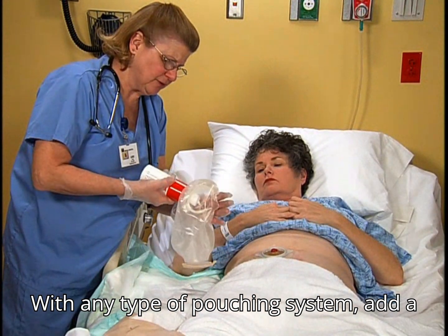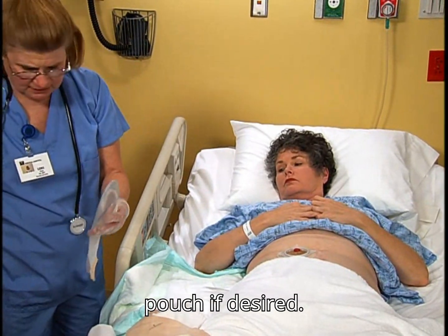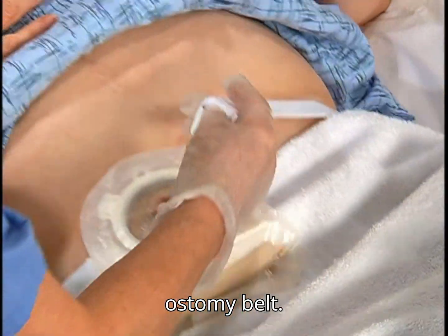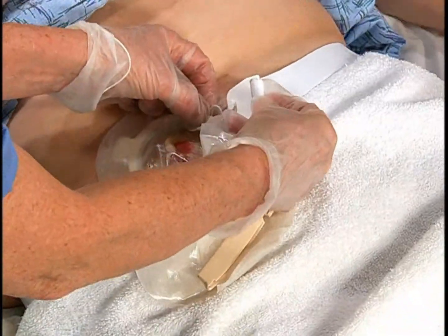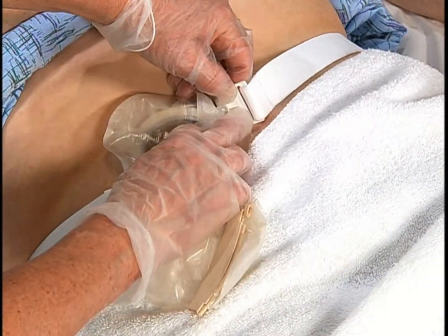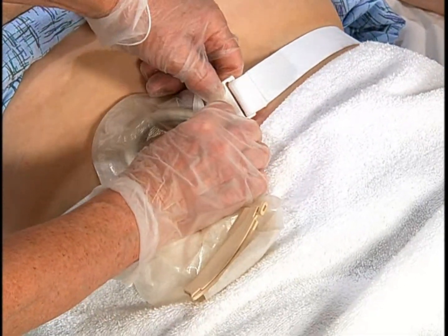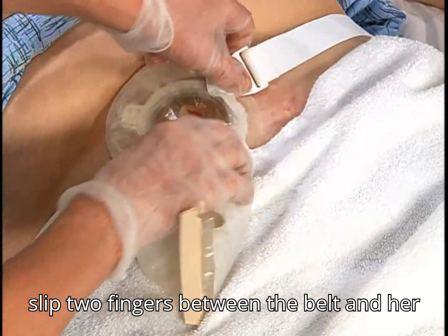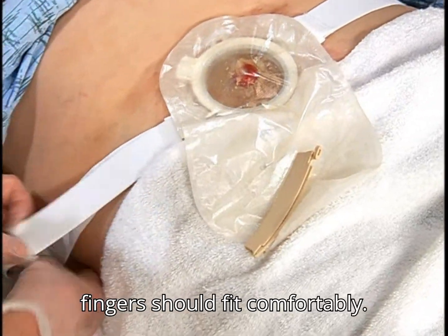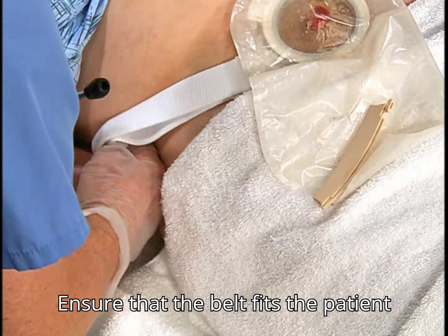With any type of pouching system, add a small amount of ostomy deodorant to the pouch if desired. If the patient desires, apply an ostomy belt. To ensure that it's not too tight, slip two fingers between the belt and her skin. Your fingers should fit comfortably. Ensure that the belt fits the patient comfortably.